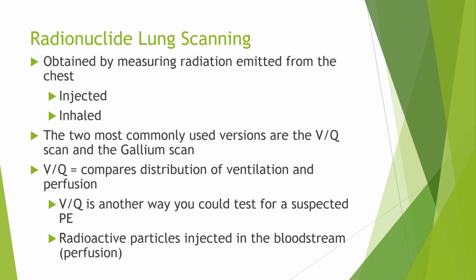All right, so that was MRIs. Be sure to be safe. Don't go too far in there. Don't just run in there. Make sure that you've been checked for metal. Make sure that you do a whole self pat down before you go into an MRI room. Now, glasses are usually okay. Like I said, most of the time glasses are non-ferrous, if you wear glasses, things like that.